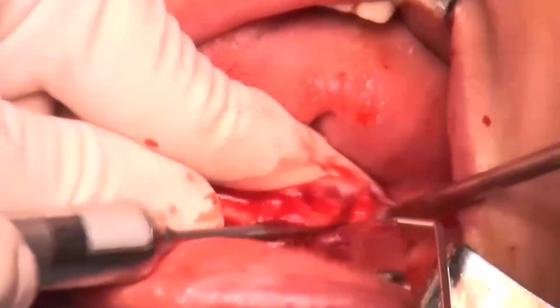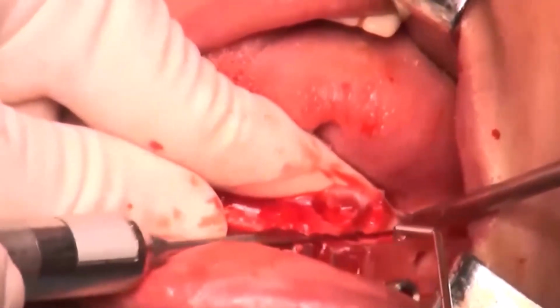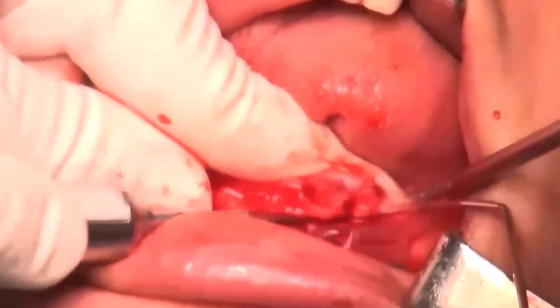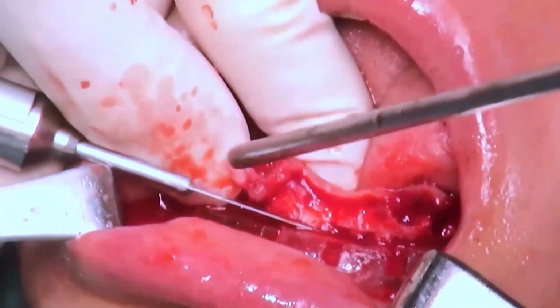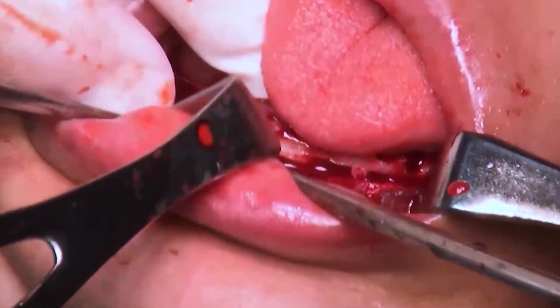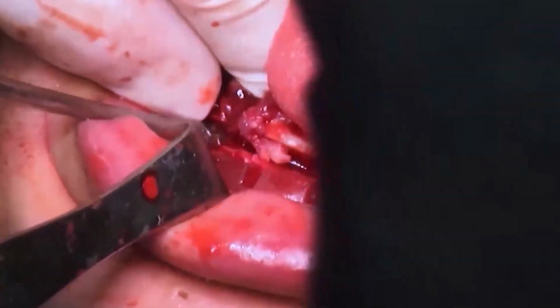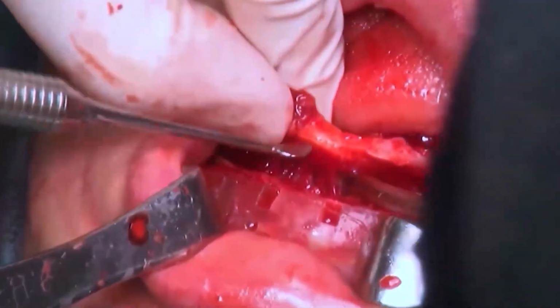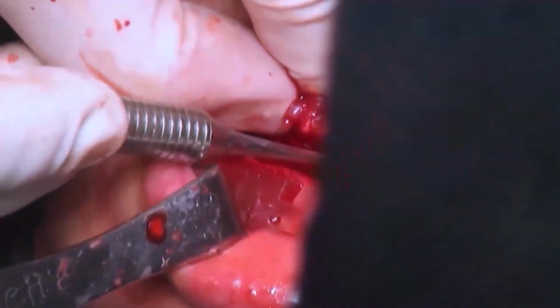My left index finger is located on the lingual side to get a sense of the sewing, to protect the lingual mucosa. And the bone segment is removed.